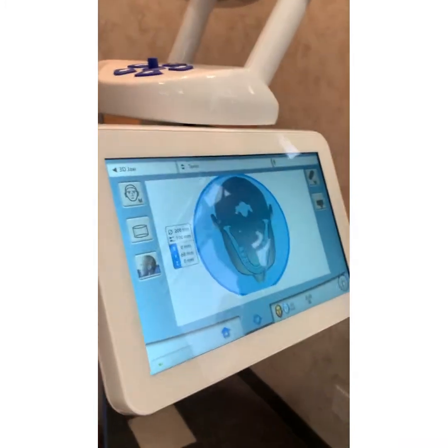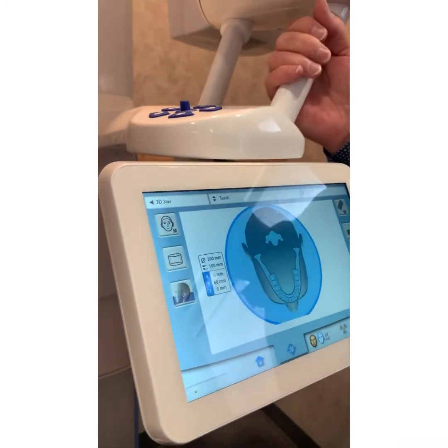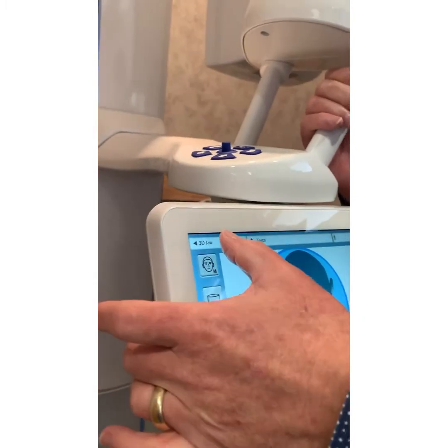A root canal on one tooth. Oh, by the way, we're going to do CTs for everybody who needs a root canal. Oh, you are? Okay. Because I could look for weird little canals using this. And that's my other question.